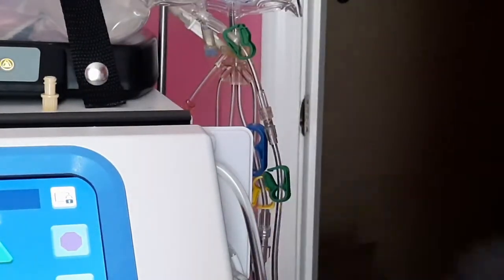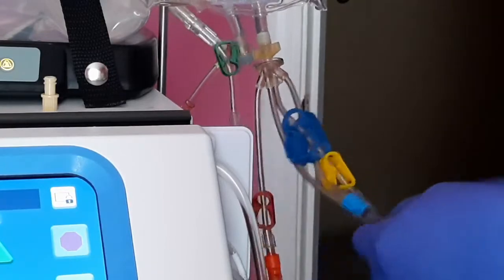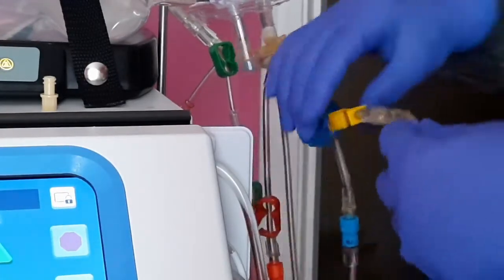Filled. Now that we've done that, what we need to do is find the yellow line, which is attached to the venous, and we're going to clamp both of these.